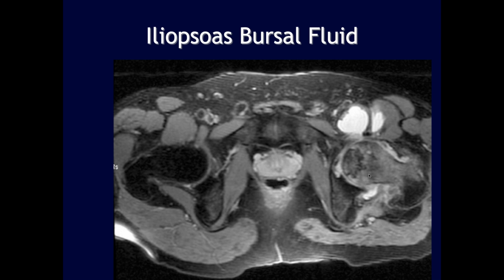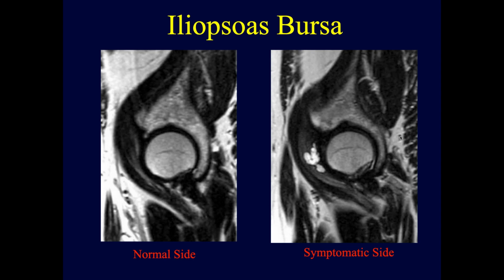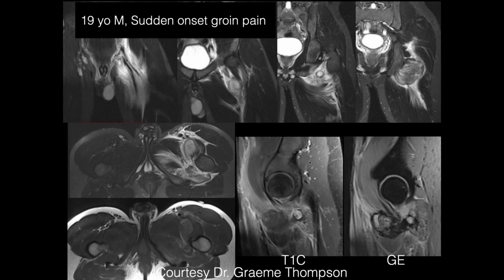Typically, fluid when you get what's called iliopsoas bursitis, which again almost always is a traumatic etiology, like we've talked about a lot of the other bursitises. And here's other examples of fluid collecting, normal side, symptomatic side, where you can see the fluid collection along the iliopsoas there. Acute.